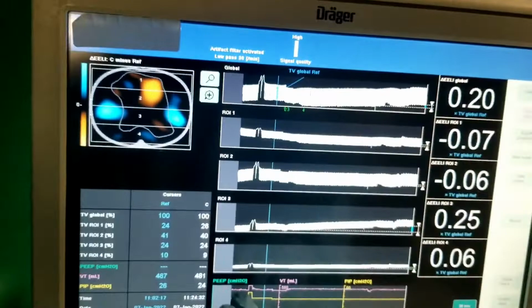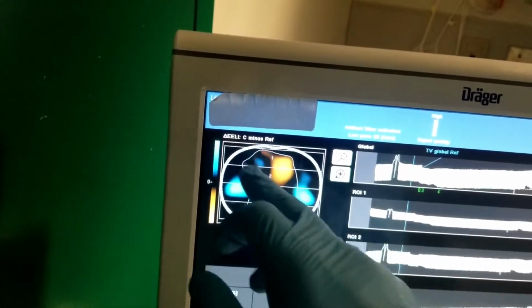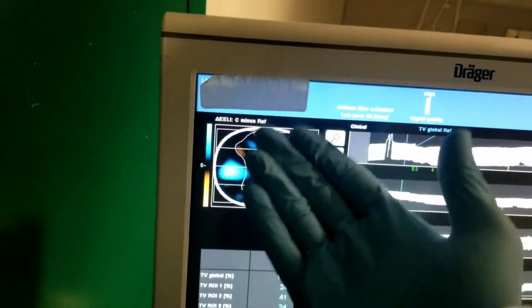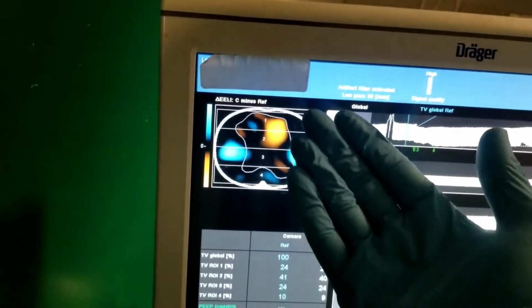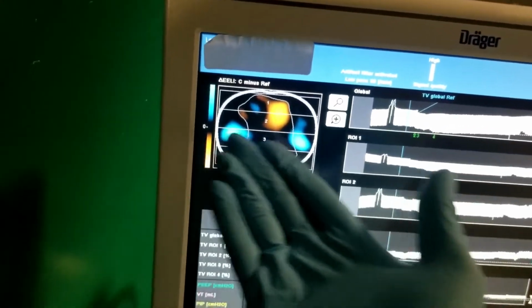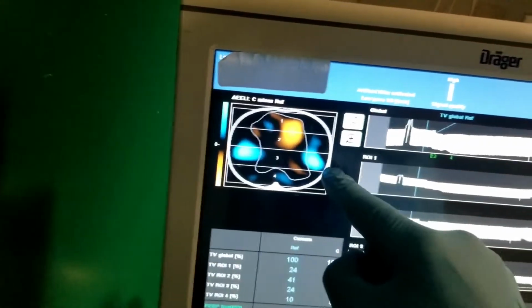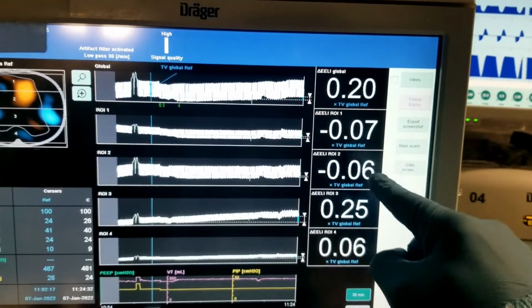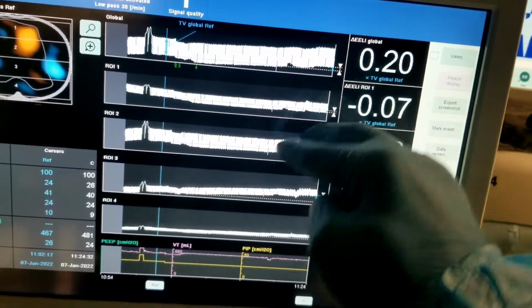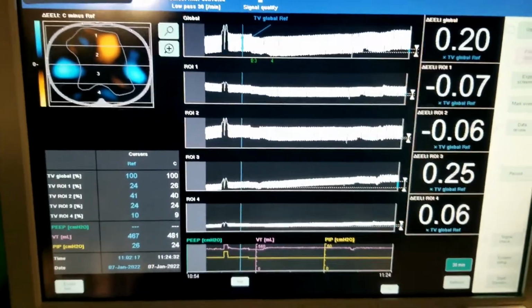So what's happening here? We decreased the P high from 26 to 24, and we have less volume in the ventral areas, which is probably not an issue. It was probably a little bit too high, and now we have less ventral filling, which is where we're more concerned. And what it's also indicating is that there's less here, but there's more lower down. Right, less here, ventral, mid-ventral, negative impedance values, and now this is lost because it's been redistributed to the dorsal and mid-dorsal region, which is excellent. That's exactly what we want.